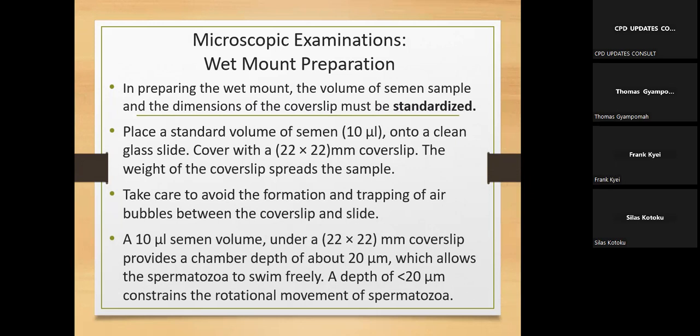And that will give you just a space for one spermatozoa at a time. That is how we say it is standardized, so that you get a one-layer suspension.